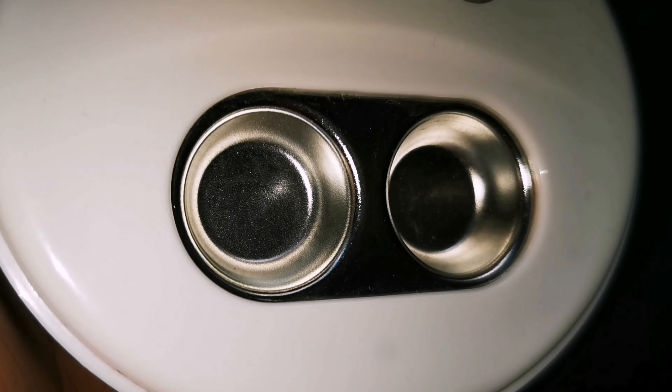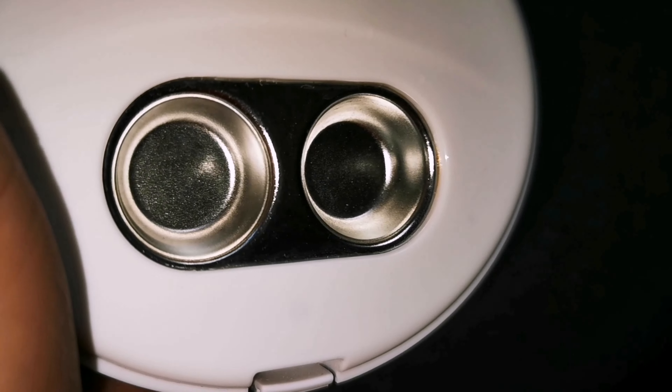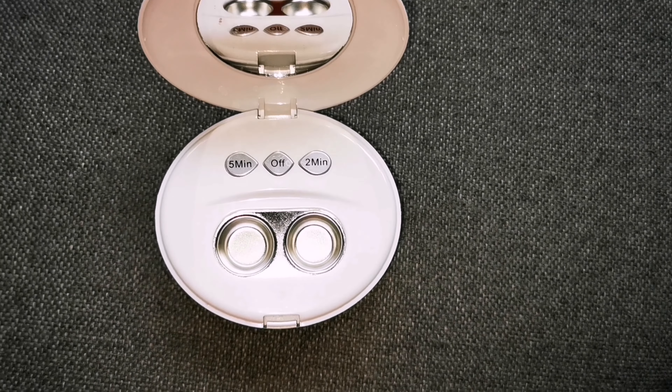You can see the difference when you clean the device every day versus after 24 hours — it's still really clean. Look at how different it is. You have to clean this device every day to make sure that no buildup gets onto your contact lens, which you put directly on your eyes.